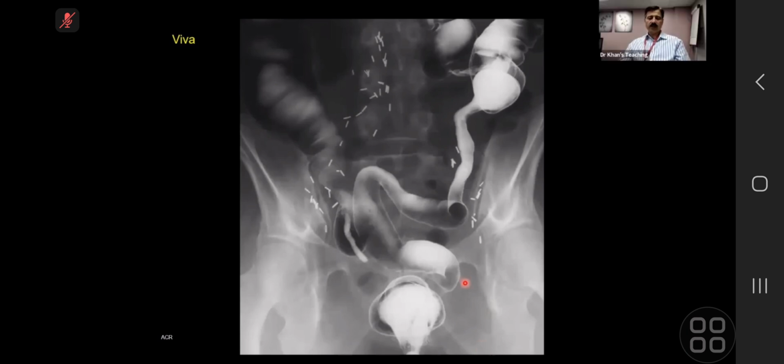Okay, fine. I'll take over. Okay, fine, good. This is a post-radiation stricture. Now, you have to again remember your pathology, and you can make your radiology from there. Basically, post-radiation changes are because of vasculitis. The small vessels of the gut will have inflammation. And this vasculitis will present acutely because there can be leaky capillaries, as well as some intramural hemorrhage, and there can be mucosal thickening, etc.